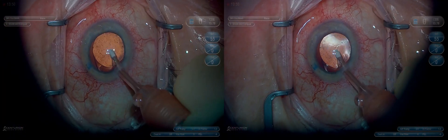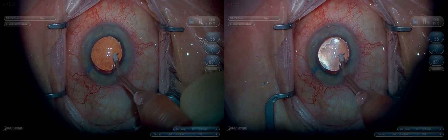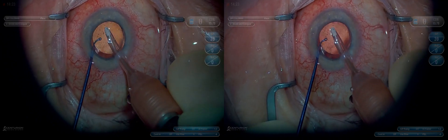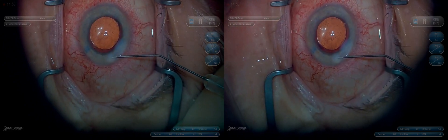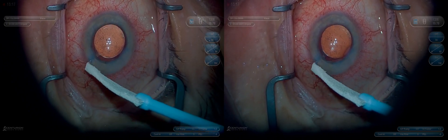Remove the viscoelastic. I always go behind the lens by sliding it over slightly. You can see even this little tiny fragment of a very thin dense nucleus doesn't come out well with the I&A, so we have to be careful to get as much of it as we can prior to I&A. Hydrate, check wounds. Beautiful case — the patient did very well.